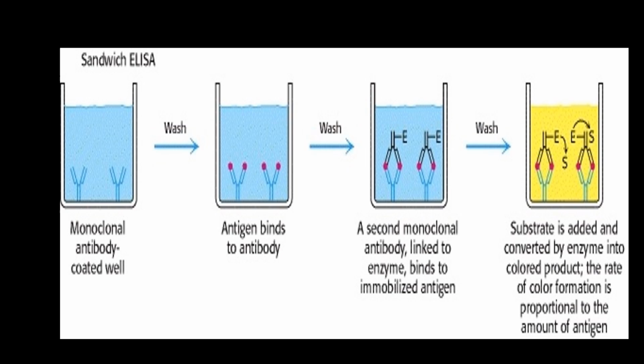Washing is necessary so that we remove unwanted or excess molecules.